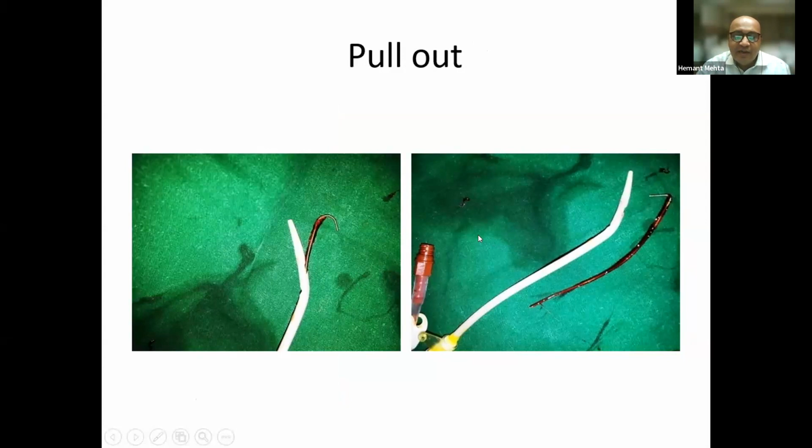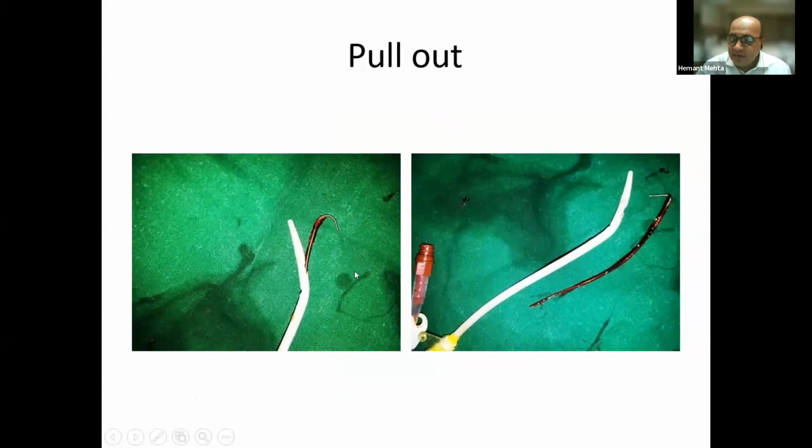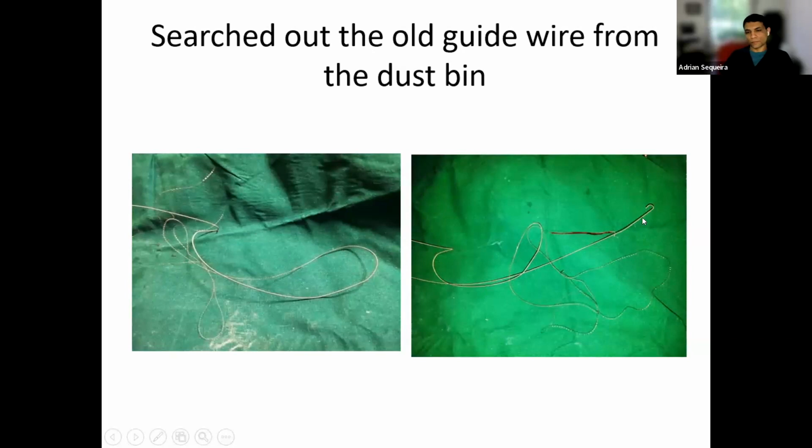So we went into the dustbin and pulled out this wire, which was lying in the dustbin. Luckily for us, we could actually do the postmortem as to what has happened. So we found this wire over there. If you realize, this was the wire, and exactly this part had got macerated. Part of it got retained and sheared off from the rest.